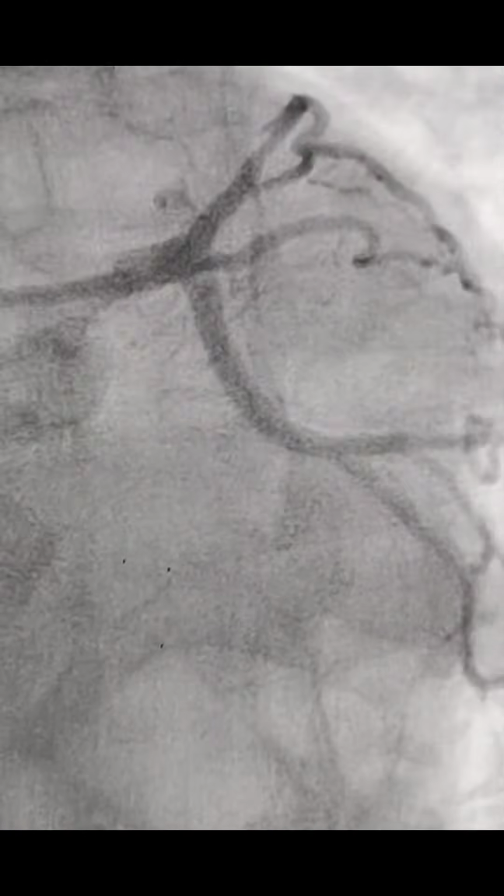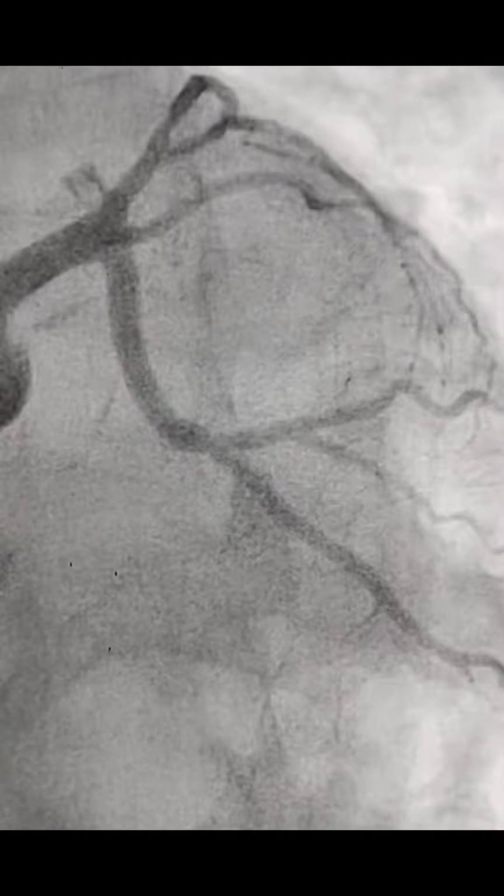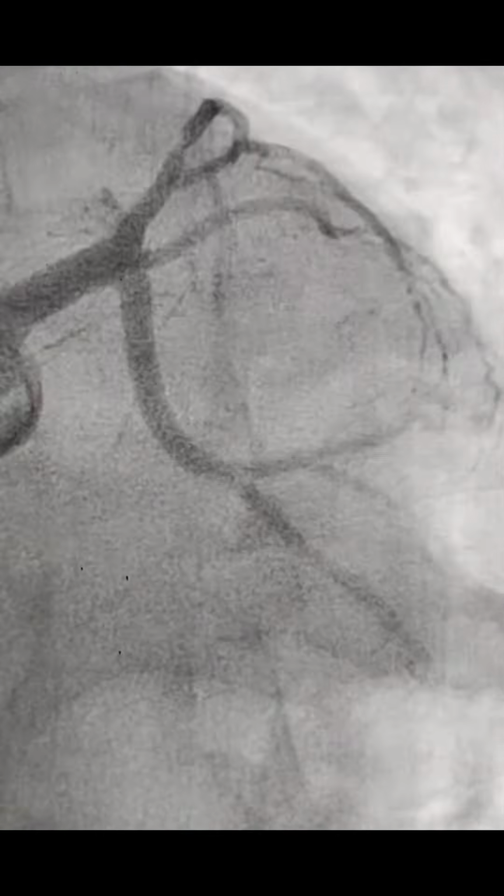So in this evolved anterior wall ST elevation MI, I tried to open this artery at the same time of angiography, but it could not cross the lesion at all, because the difficulty is that the major LAD is having a 90% angle to the left main, so there was a difficulty. So what we decided is to give a GP2B3 inhibitor for 12 hours, and then we will try to open this LAD.